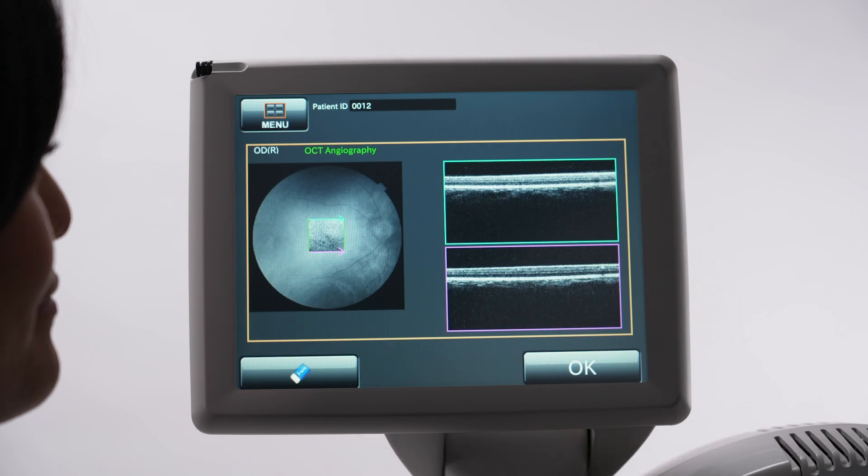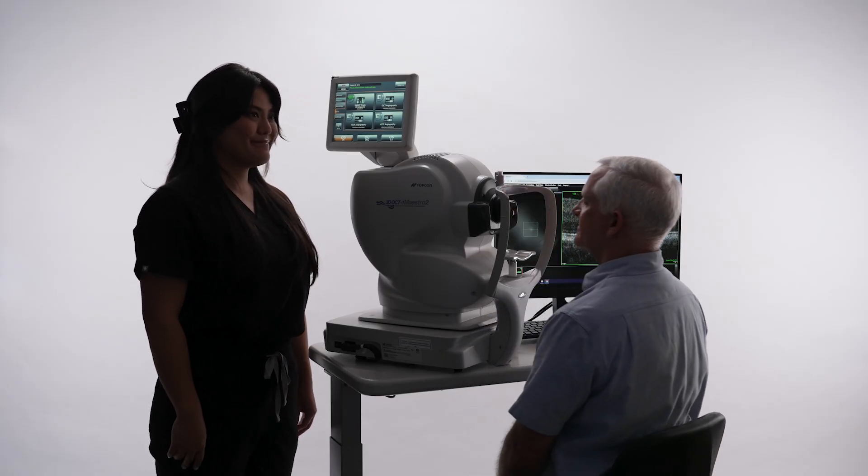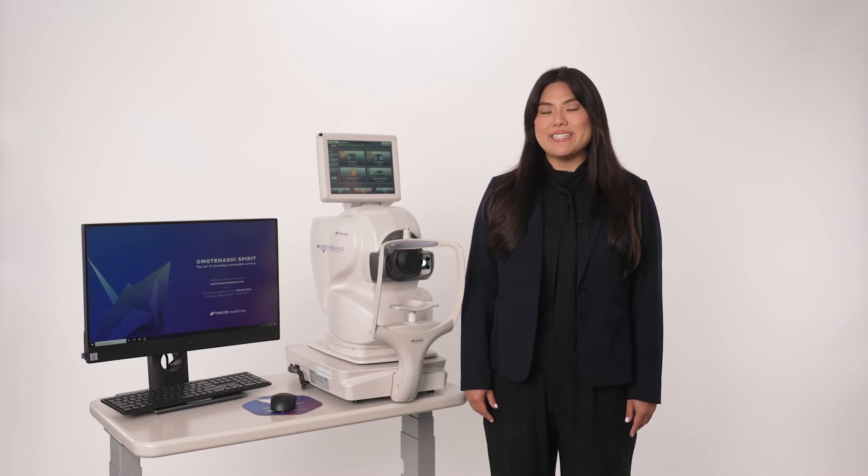A preview image is displayed on the device screen. Press OK to save the OCT angiography image. And that's how you capture an OCT angiography image using the Maestro2. For more information, please visit Topcon Healthcare University.